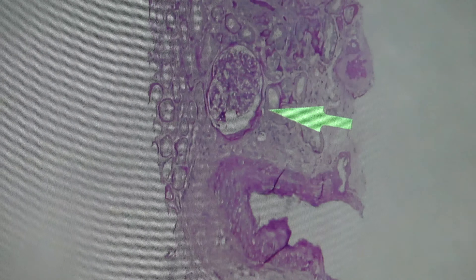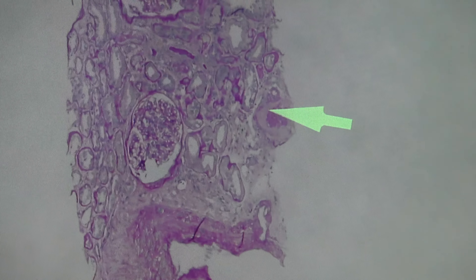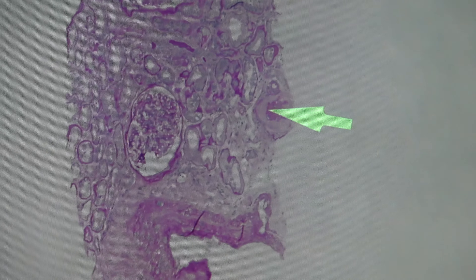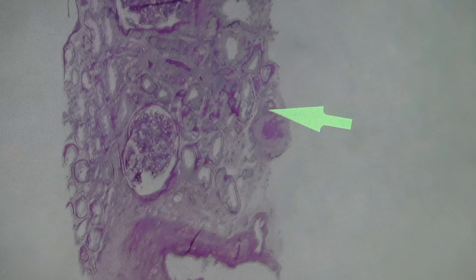At this level there are five glomeruli — one, two, three, four, five — and this one is completely sclerotic. So at the glomerular level there is 20% glomerulosclerosis.